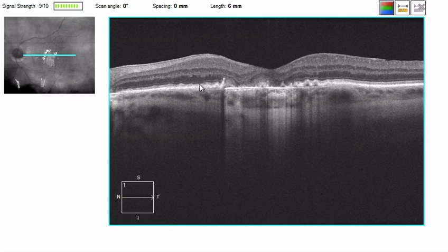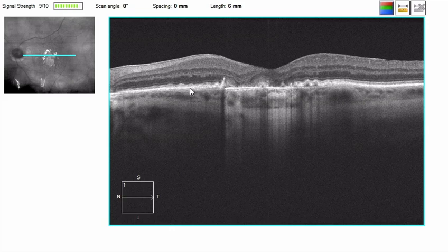We see the RPE continue out, and in this area we see some thickening. This is all suggestive, based on the appearance of the outer retina, of a patient with dry age-related macular degeneration with geographic atrophy — and that is what we have. These are Drusen that have begun to lose their material, and this is an area where there is atrophy. There is central sparing, as is typically the case in geographic atrophy.